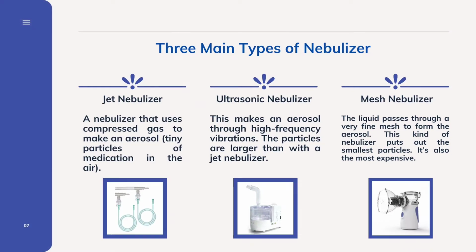Additional information: nebulizers are either electric or battery powered and are either portable to carry with you or designed to sit on a table and be plugged into the wall. A base that holds an air compressor, a small container for liquid medication, and a tubing that connects the air compressor to the medication container are all included in the mentioned types of nebulizers.